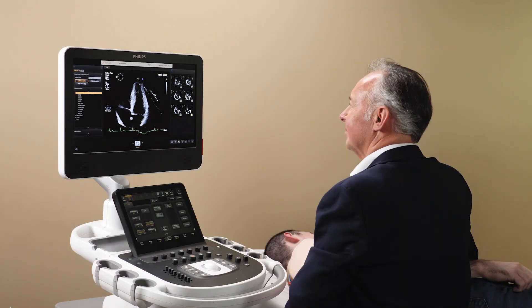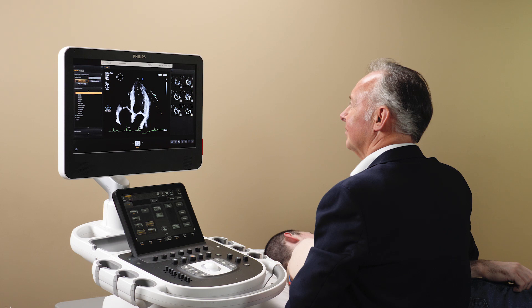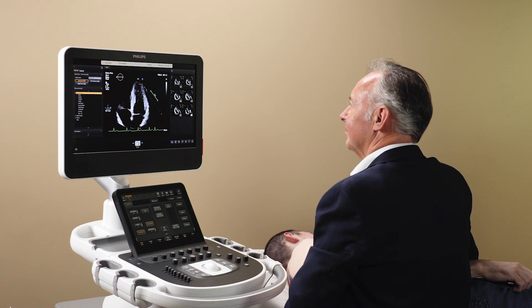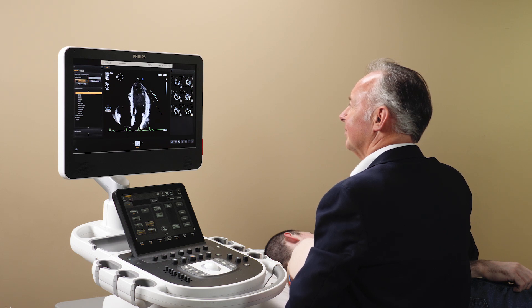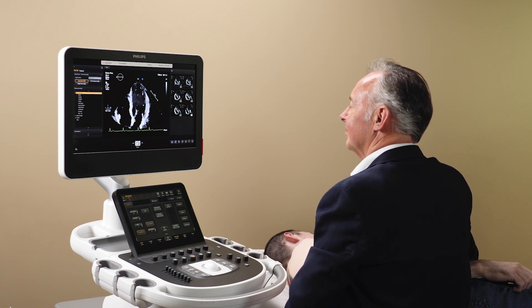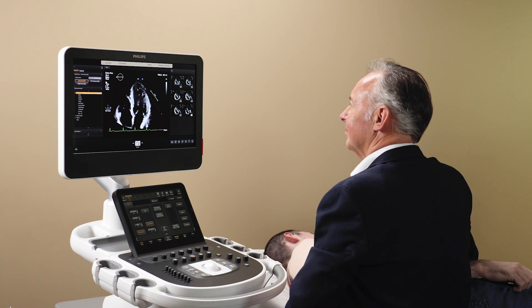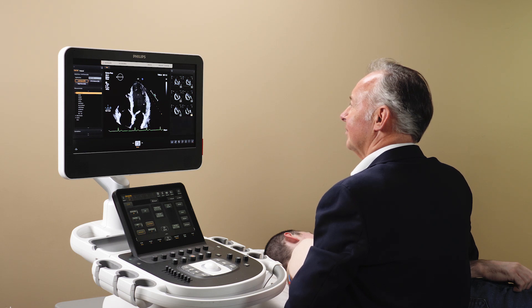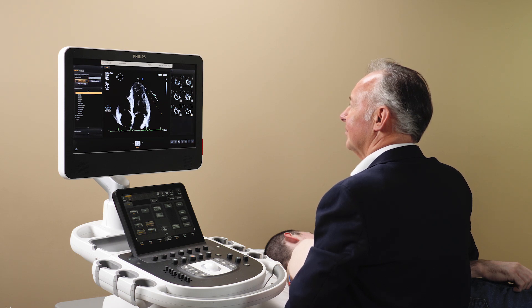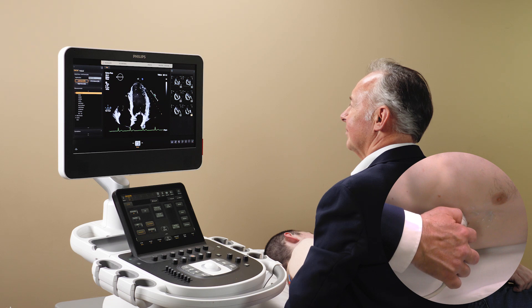To calculate the longitudinal strain of the right ventricle, we need to acquire an RV-focused apical 4-chamber view with a minimum loop length of 2 beats. Make sure you have a good ECG signal.